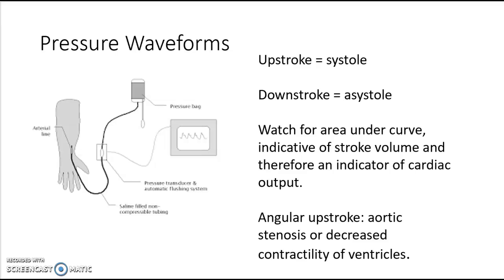Decreased afterload is also indicated when the tracing increases during the inspiratory phase of the vent.